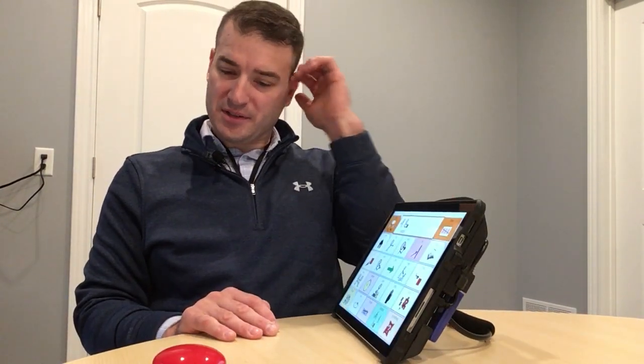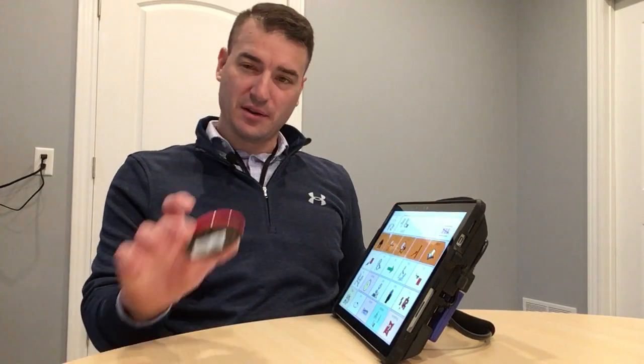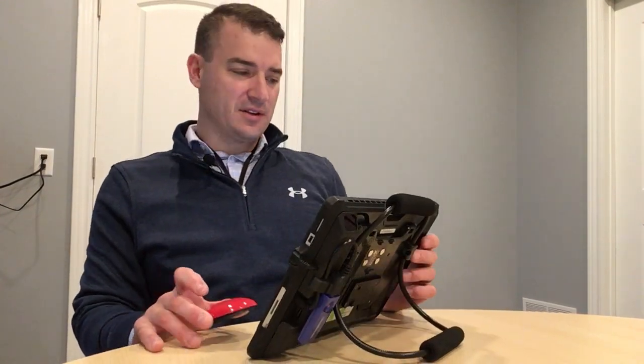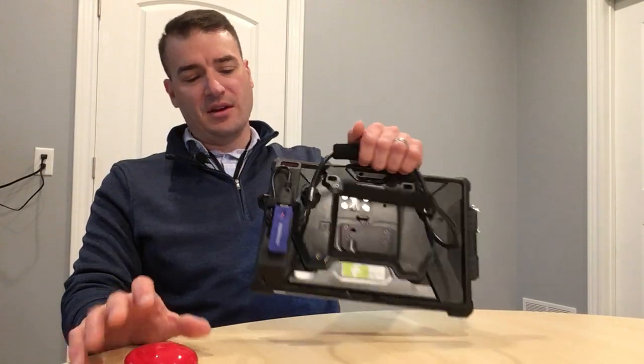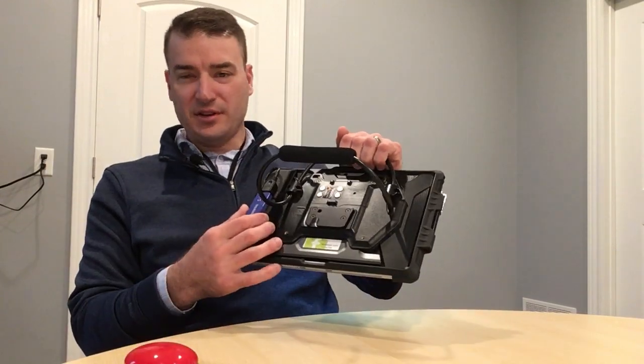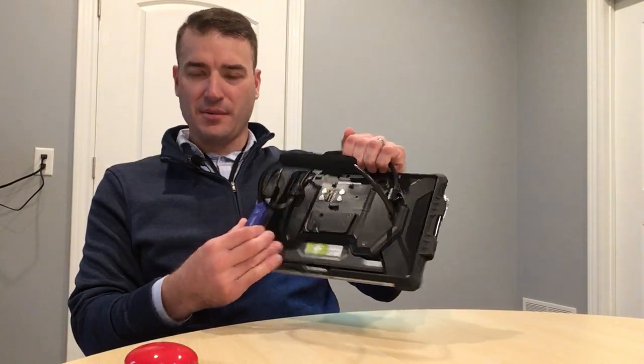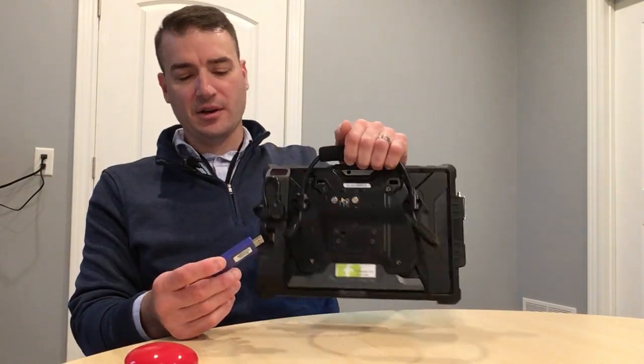So that's row column switch access, and you can see it would take a while to generate your sentences, but a lot of users become very proficient at this, and it's an access method that we definitely designed in preparation for.